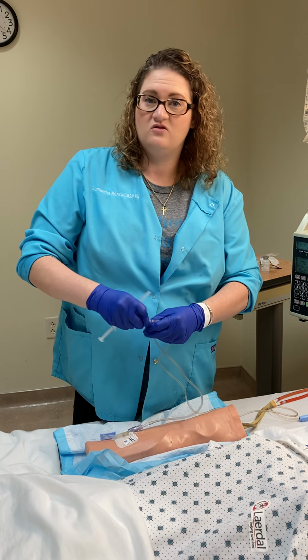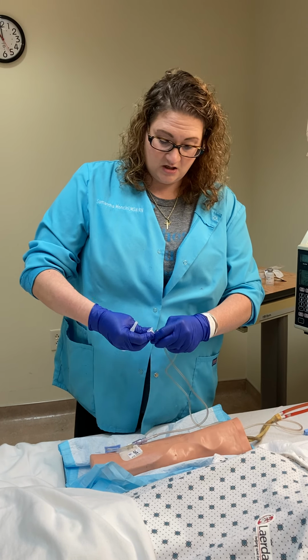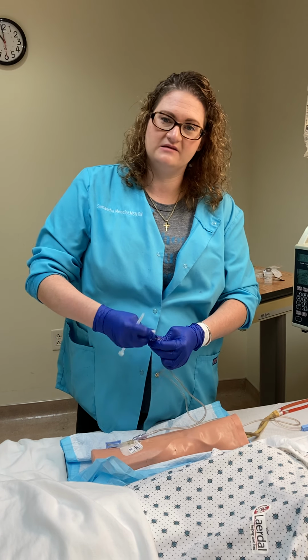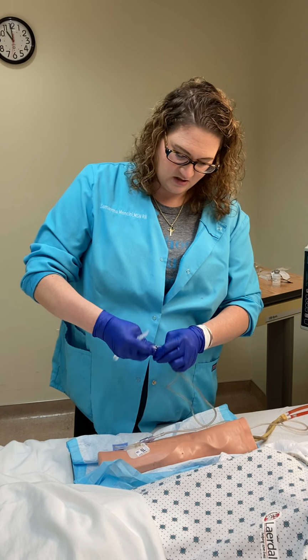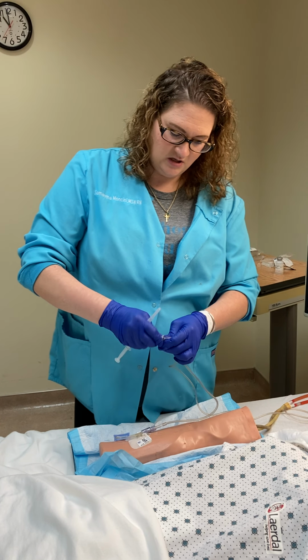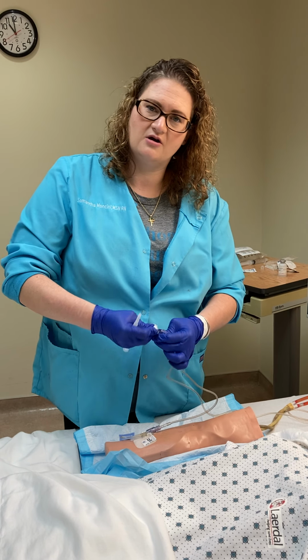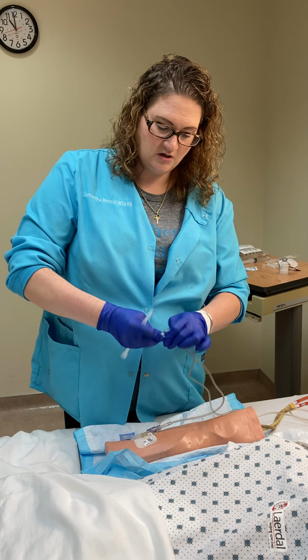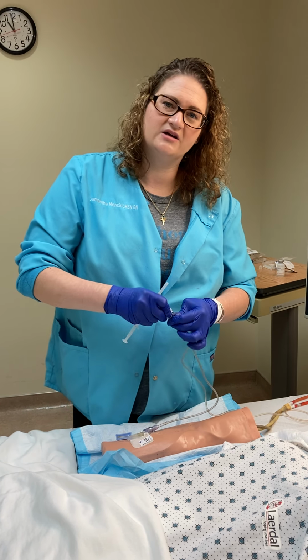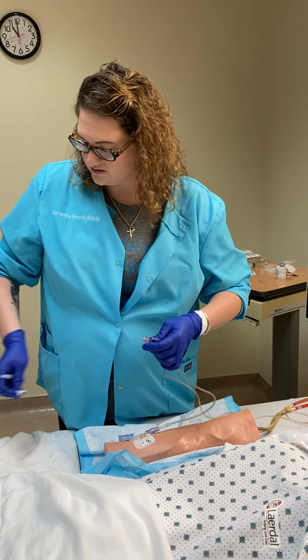I know that I need to administer this medication over a 2-minute time frame by looking it up. So you always want to look up your push times on your meds so that you don't cause your patient any issues. And also whether or not it needs to be diluted. Most medications now are already pre-diluted, but some might need to be further diluted. So take a look at that, and then also look at your packaging for your medication, because that'll instruct you as to whether you need to dilute or not.